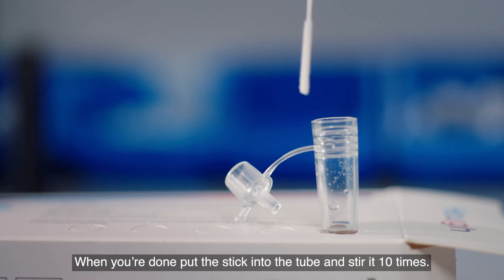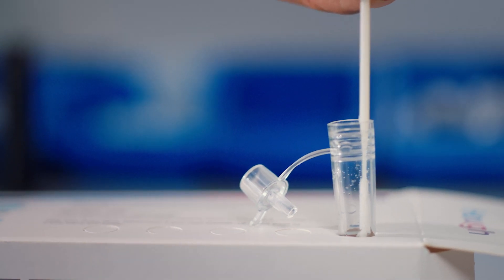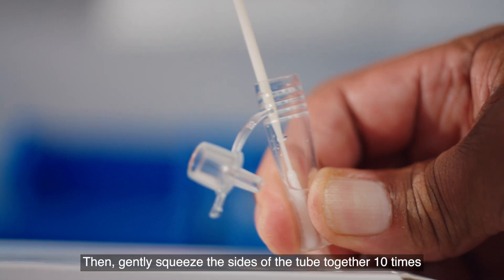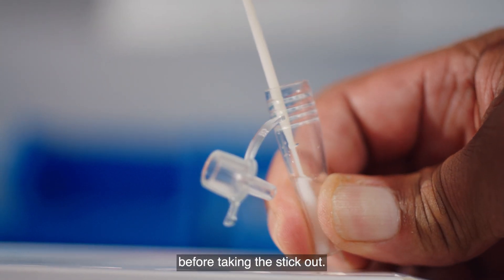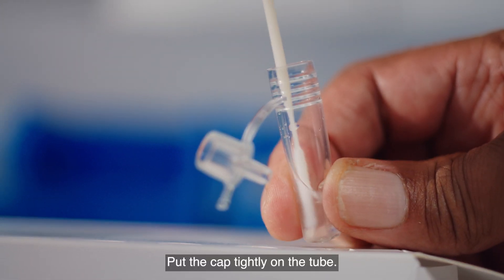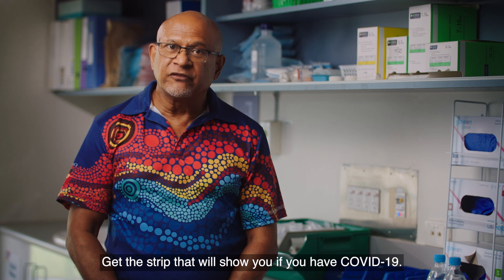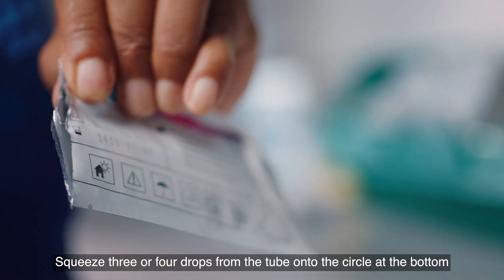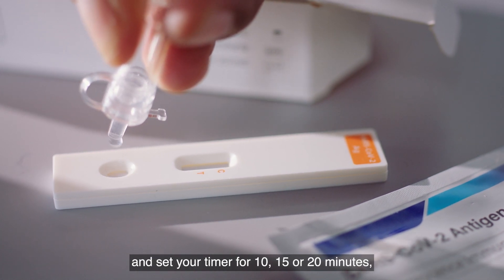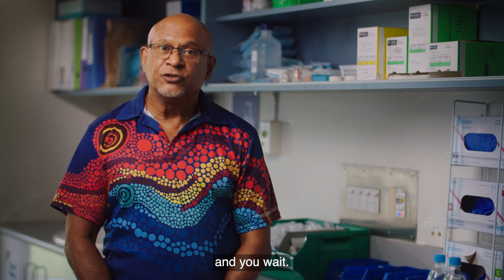When you're done, put the stick into the tube and stir it 10 times. Then gently squeeze the sides of the tube together 10 times before taking the stick out. Put the cap tightly on the tube. Get the strip that will show you if you have COVID-19. Squeeze three or four drops from the tube onto the circle at the bottom and set your timer for 10, 15, or 20 minutes depending on what your kit says. And you wait.